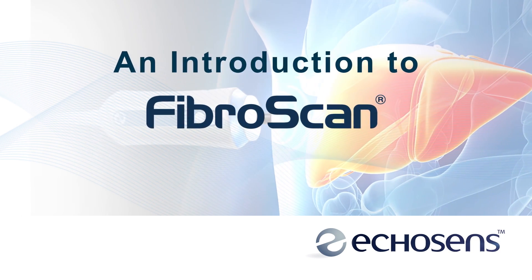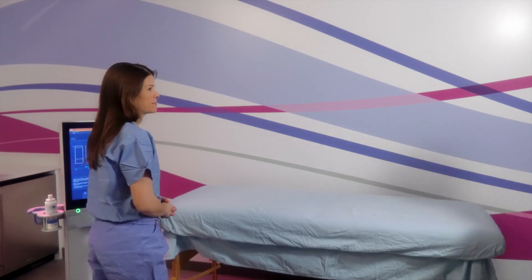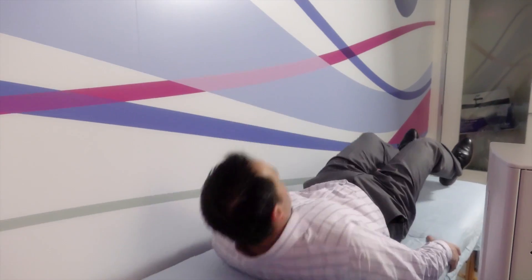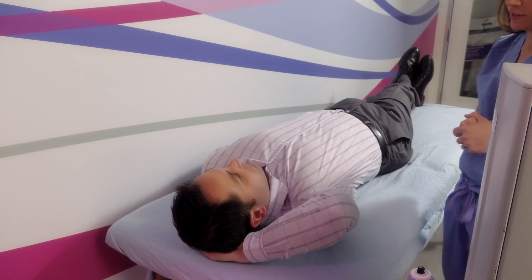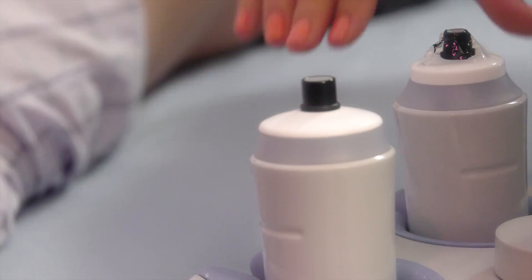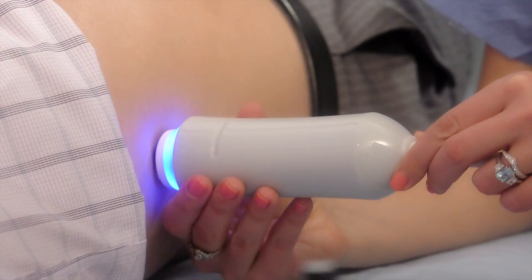The following is a demonstration and explanation of what you can expect to experience during a FibroScan examination. The FibroScan operator will have you lie on your back and ask you to raise your right arm behind your head. With your shirt pulled up to expose your ribcage, allow the operator to correctly locate the FibroScan probe. The painless, non-invasive procedure will then begin.